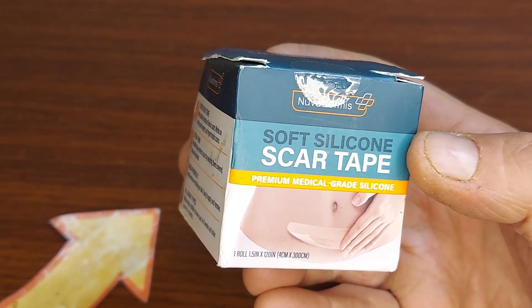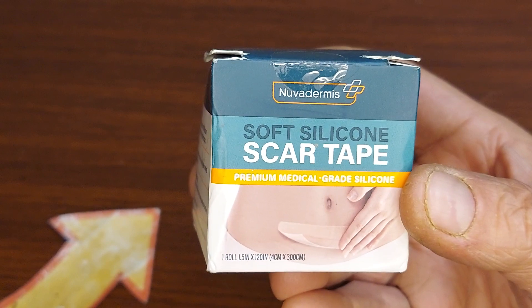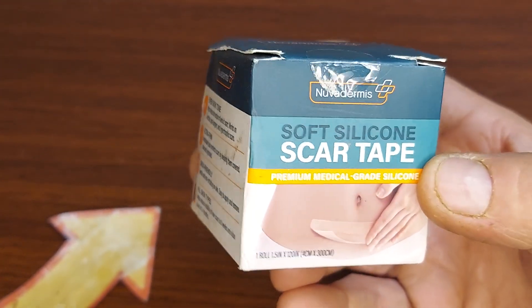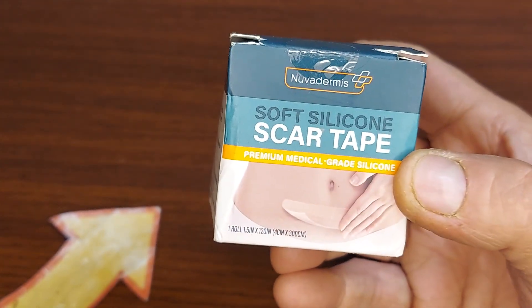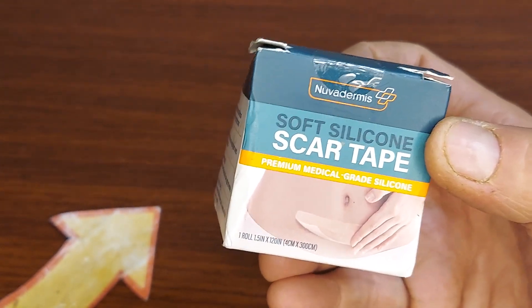It's very adhesive and it's reusable. You can clean it, and you want to wear it for a maximum of 12 to 24 hours, then let the scar breathe. After that, you can put it back on or use some more.